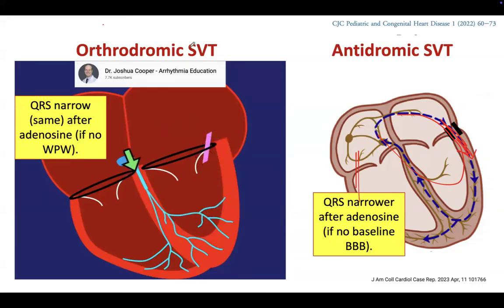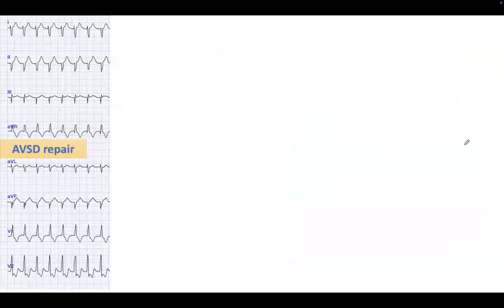No, antidromic is wide. Then you're going down an accessory pathway, but after adenosine it will be narrower. Yeah. But you will see delta. You will see P, and then you have to see delta QRS. It will narrow down, but not normal, because there's delta, because you have an accessory pathway that goes up to down. Good point. Okay. So that's versus aberrantly conducted SVT.